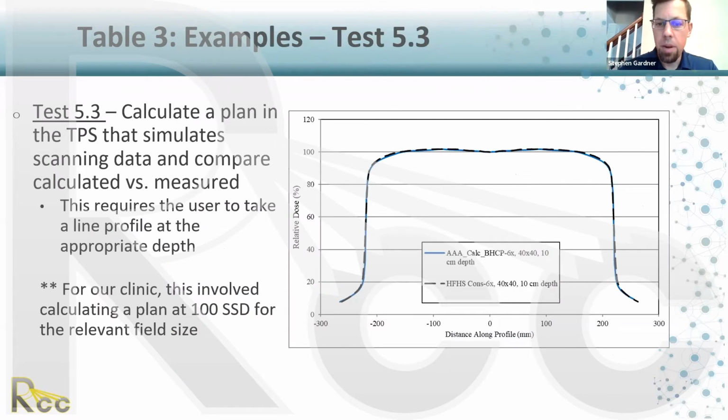Oh, great question. So I'm going to go back into this slide. Can you see my pointer, my mouse? Yeah. Okay, great. So this would be the high dose region, this inner part. If this is the field edge, the 50% isodose line right here, and right here, the inner 80% of that field size is going to be the high dose region. And then this is the penumbra, going from 20% to 80% of the high dose value on the central axis. So here's the penumbra on this side, and out of field is going to be over here, not really shown in the plot.